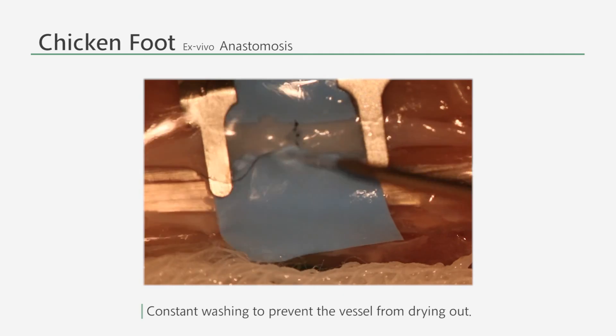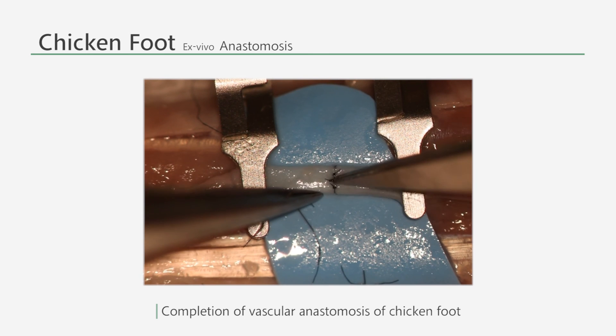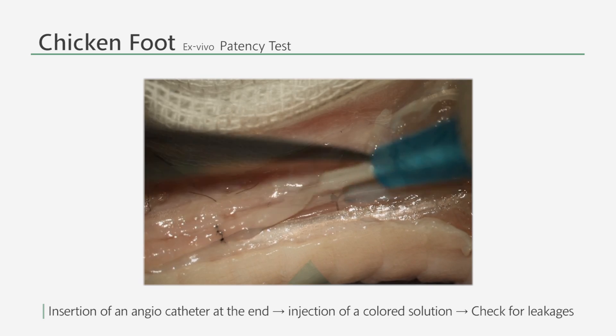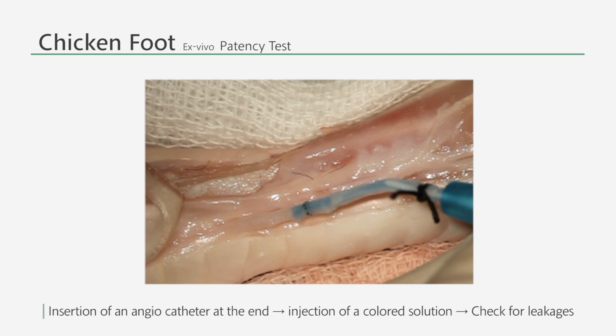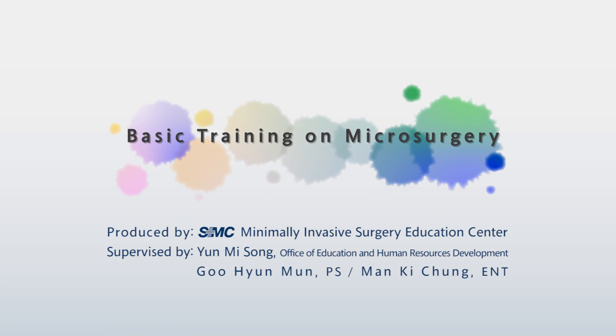Remember to keep the vessel wet while practicing the suturing. In order to check for patency and for any leakages, carefully insert an angiocatheter filled with a colored solution at the open end of the vessel. Please check if there are any anastomotic leakages under the microscope. This is the end of the basic training on microsurgery. Thank you.